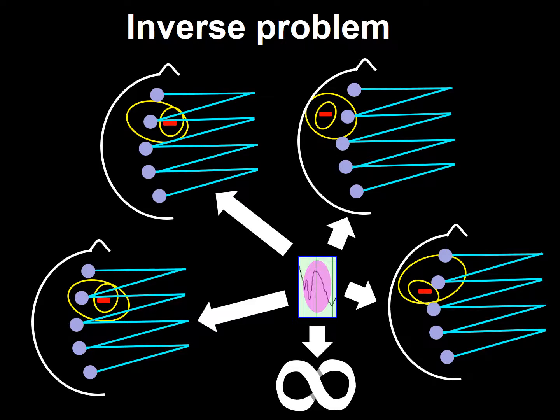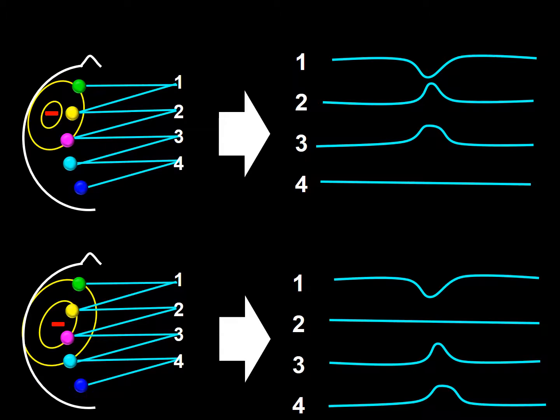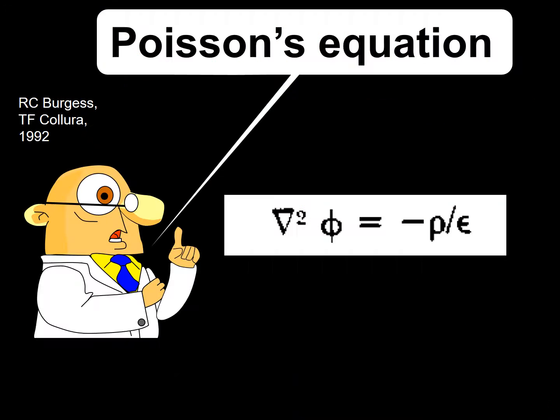On the other hand, where we do know all the qualities and configuration of a voltage source or generator and the medium between the generator and the capturing electrode, we would be able to correctly predict its EEG electrical event representation. This is called the forward problem. The forward problem, as I just told you, has a unique answer.